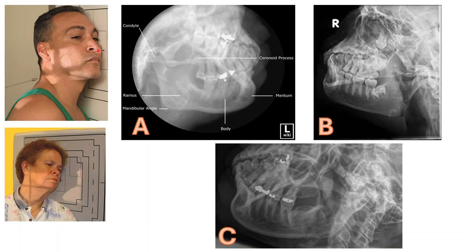In this first position, we have a patient with their face and head in a true lateral position with the IPL perpendicular to the IR. In this positioning, we would need to use a 25-degree cephalad angle on the tube. We're going to be projecting this mandible superiorly so that we can leave the mandible that's closest to the IR free of superimposition, because the mandible on the IR is the mandible of interest.